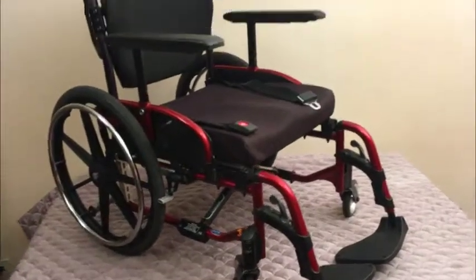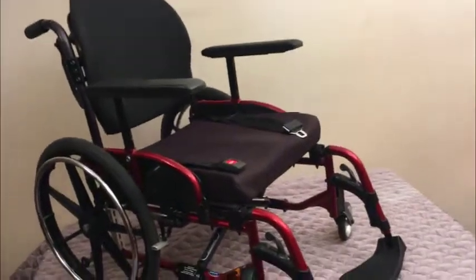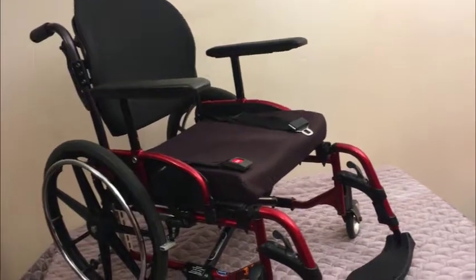Hey guys, my fantastic Invacare Mayan smaller size wheelchair. Let's go through it.